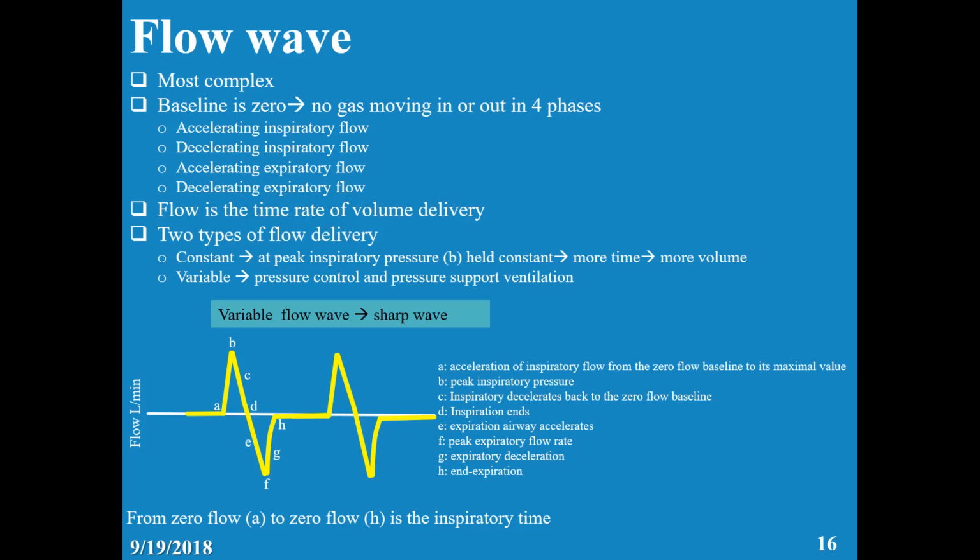So when there is a hold in the flow, is it volume or pressure control? When you take time in the flow, do you give pressure or volume? Volume. It takes volume. Once you need to inflate a balloon, you need time. Remember that. But if you want to blow a feather or a paper, you need to blow very strong to make it fly, to give pressure. So once you see a hold, then this is volume.